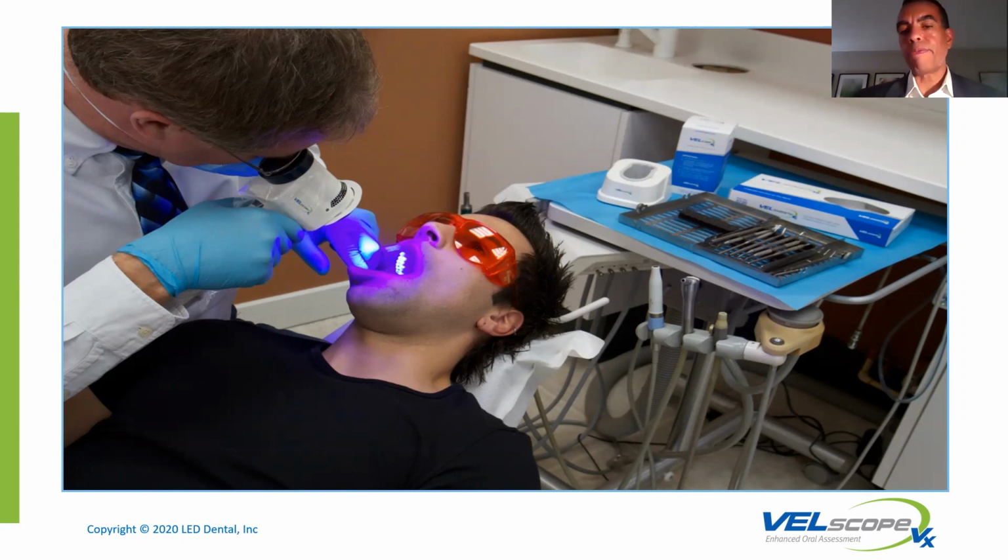Up and down, left, right, for the mouth, back of the throat. Once you get comfortable, after 5 to 10 patients, it shouldn't take more than a minute, max a minute and a half. If there's something that you need to follow up with, you do that. And from that, you're done.